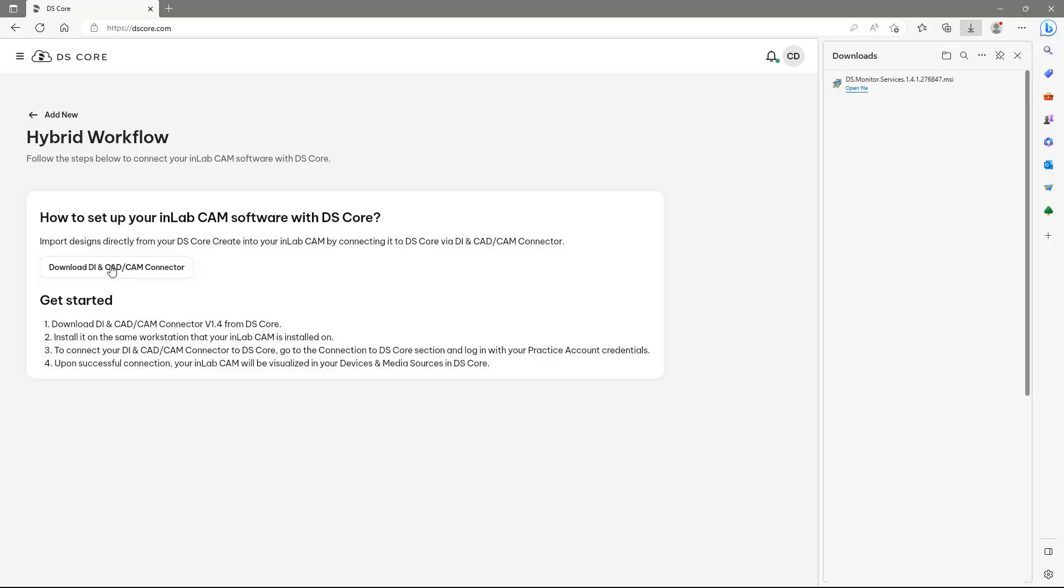As soon as the download is completed, we tap on Open File. Please make sure that you are connected to your practice network at this stage.